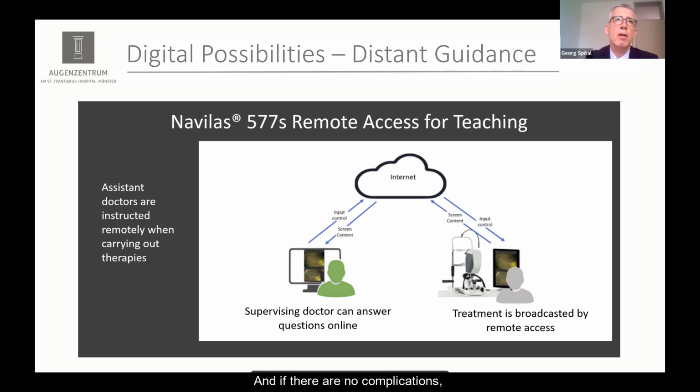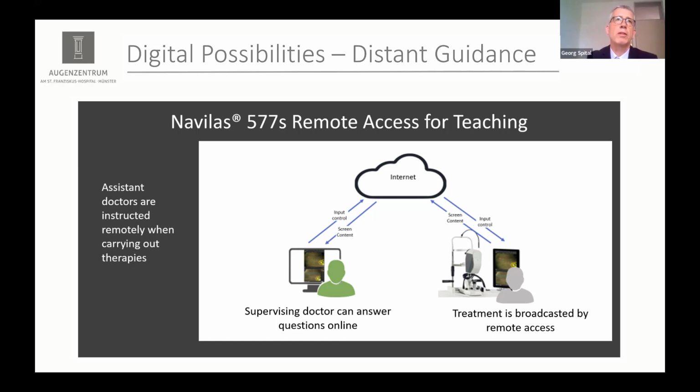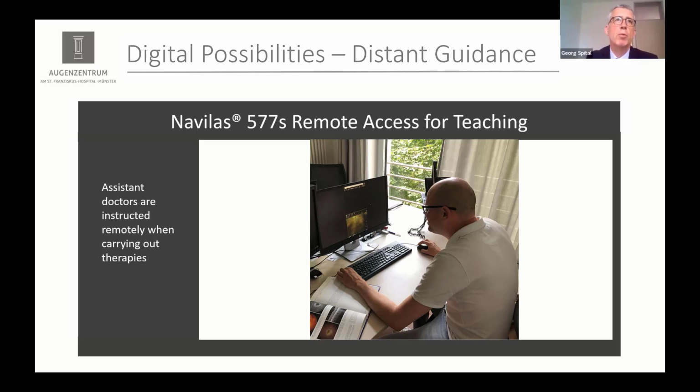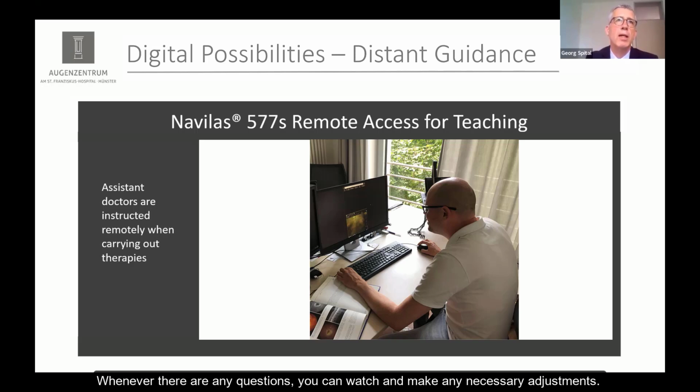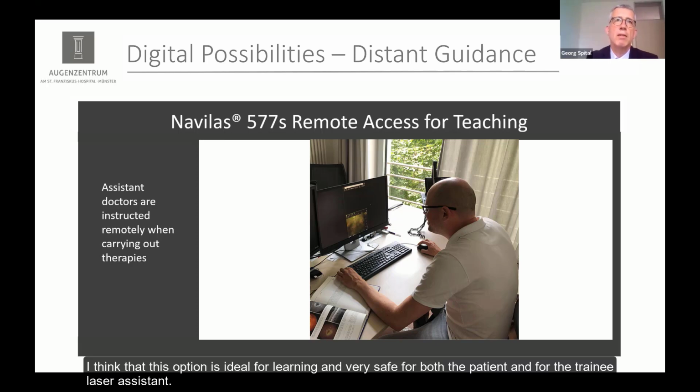And if there are no complications, you do not really need to intervene and you can get on with other work at the same time. Whenever there are any questions, you can watch and make any necessary adjustments. I think that this option is ideal for learning and very safe for both the patient and for the trainee laser assistant.